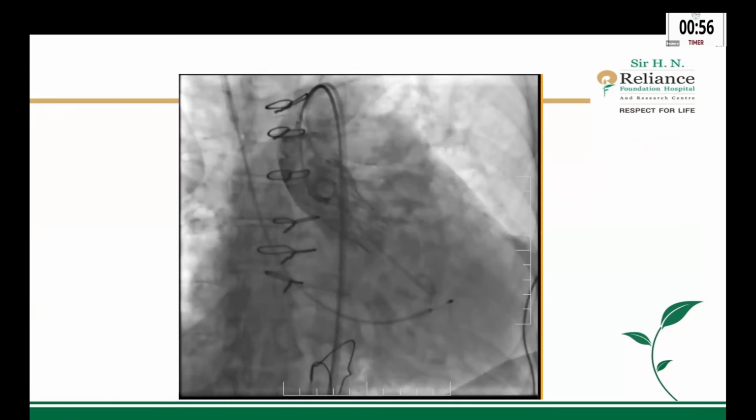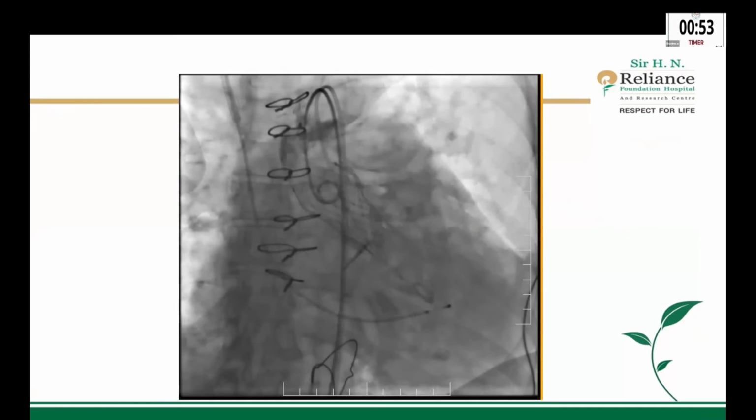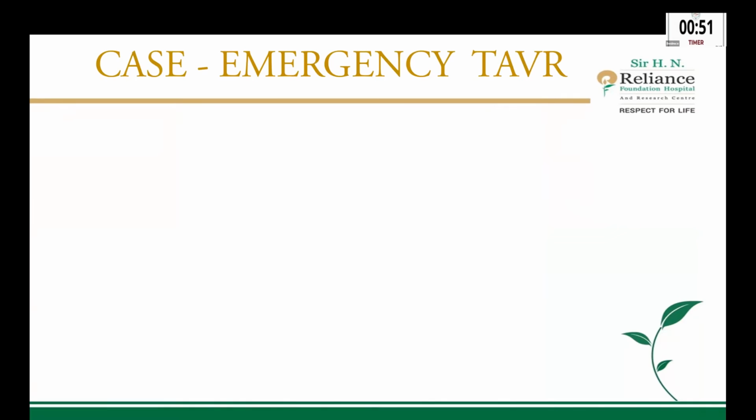Metallic valve functioning well and TAVR valve sitting very well in the aortic position. This is the sickest of the patients and probably my last case.